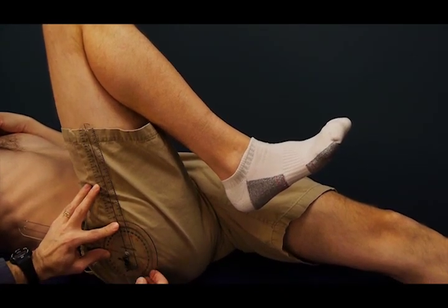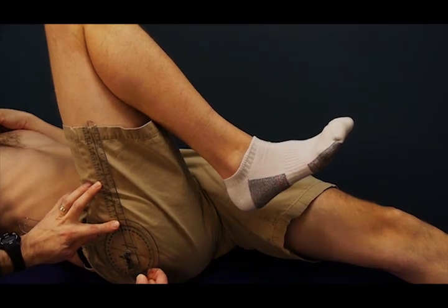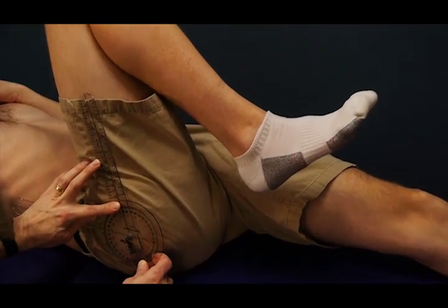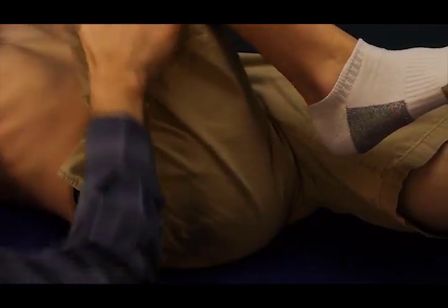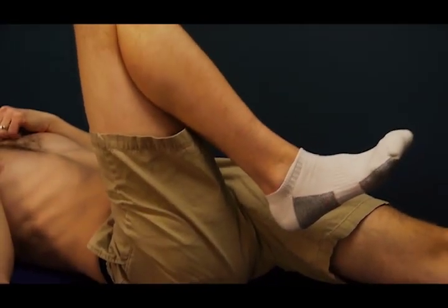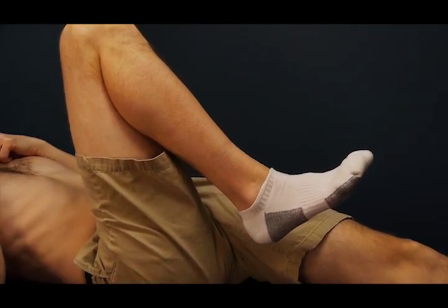Something like that. And so in this case we have about 112 degrees of hip flexion. The knee is bent when you do this to eliminate any hamstring shortness from interfering with the hip flexion measurement.